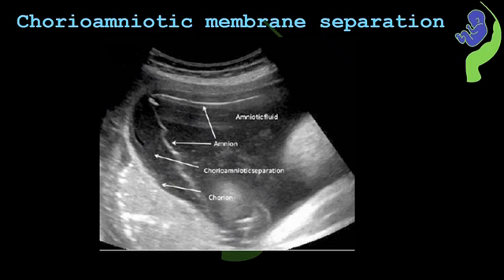We have prepared a separate detailed video on chorioamniotic separation, which I recommend you to watch. That video will not only explain the pathophysiology of this finding, but we will also cover all the differential diagnoses of membranes seen within the uterine cavity, which will help you in distinguishing true chorioamniotic separation from other mimicking conditions.